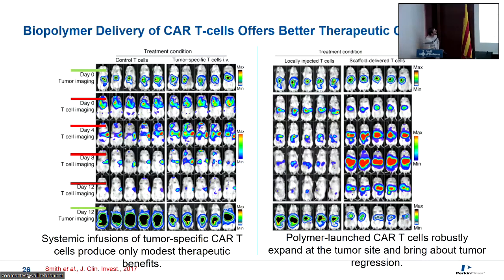targeting the tumor. Using IV injection, we can see that the T cells, again, are making their distribution from the lung to the liver, and a good amount of them will be able to target the tumor, so we can find T cells starting from day 4 up to day 12. We can find some T cells colocalized with the tumor. And here we did another tumor measurement at 12 days, so at the end of the study, to see what was the growth rate between day 0 and 12 days.